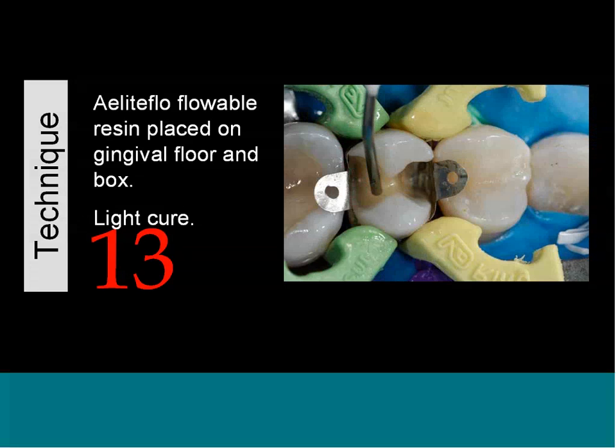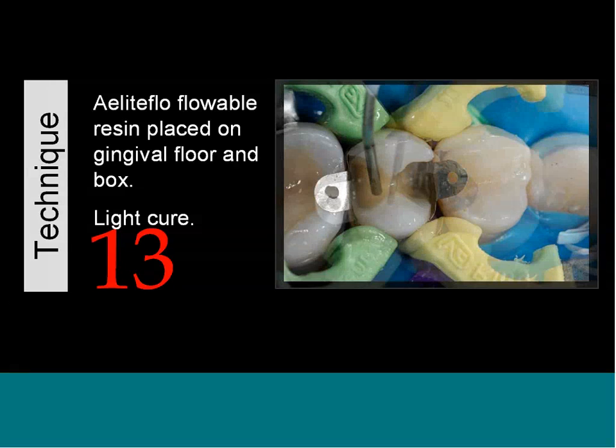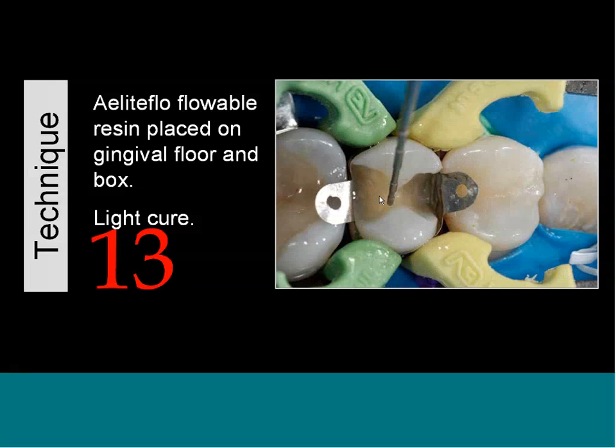Then the next step would be to take some Elite Flow and place it on the gingival floor. So we're doing that, place on gingival floor, a little bit down in the box, and then we're going to take an explorer or a perioprobe, in this case a perioprobe, and make sure that we spread this around, and you want to get it right down to make sure that it adapts intimately between the matrix, the metal, and the gingival margin down here in the proximal box, and then light cure it.